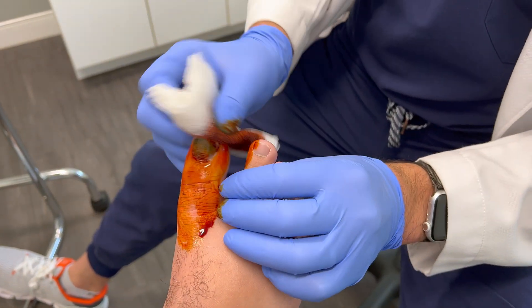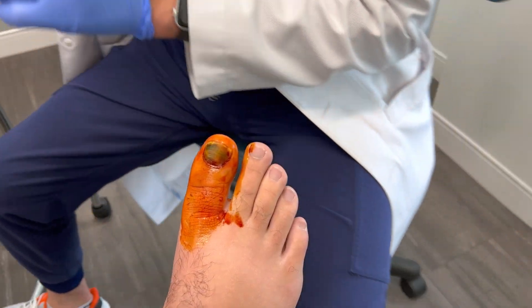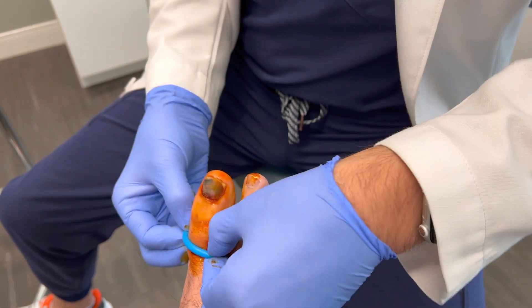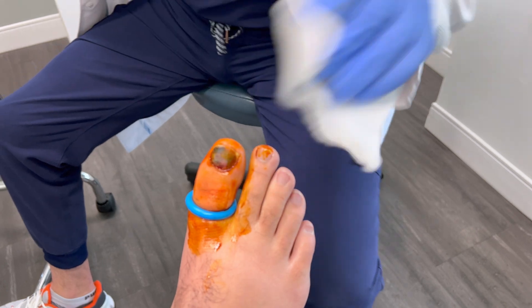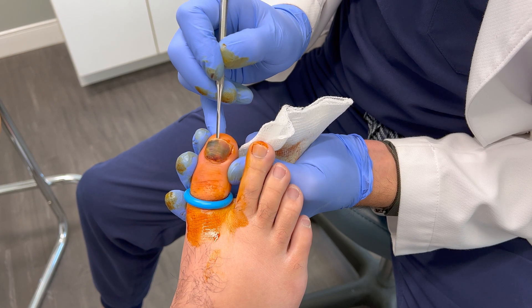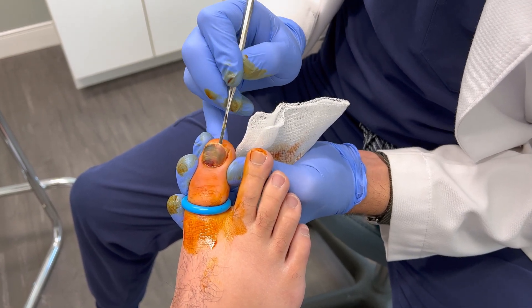Hey everyone, Dr. Noldman, board-certified foot and ankle specialist. I have a patient here today. He had presented after someone had stepped on his toe with a soccer cleat on two separate occasions. Due to persistent drainage and pain associated with the toe, it was recommended that the entire toenail be removed. This is called a total nail avulsion.